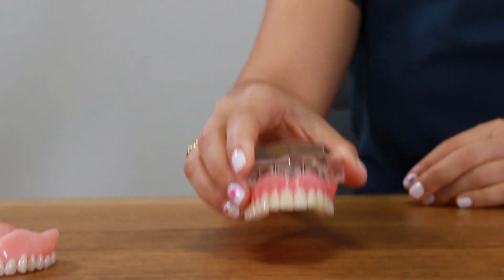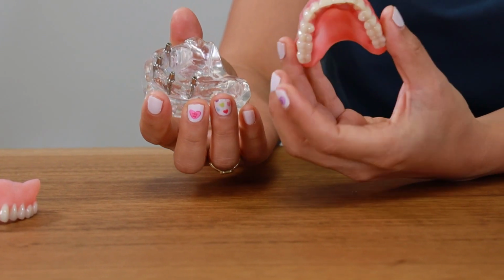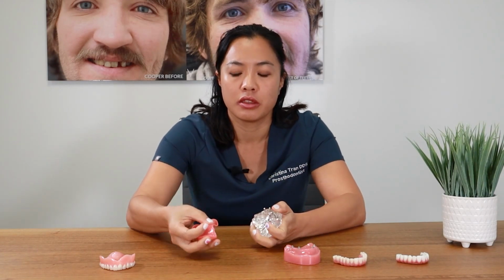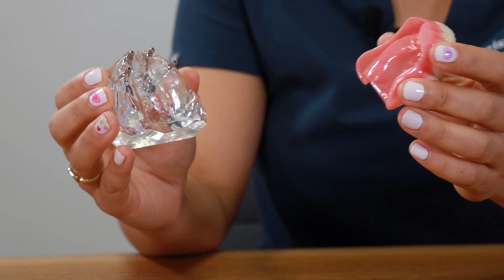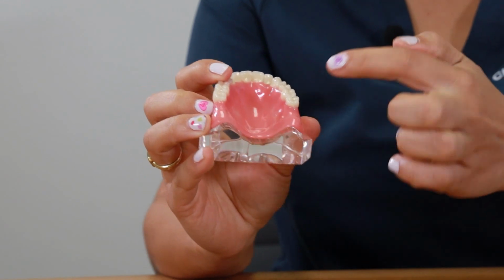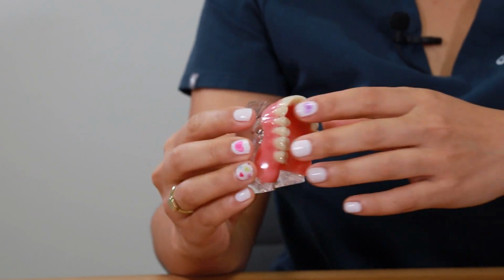Our next device is a snap-in denture. A snap-in denture is kind of middle of the road in terms of cost and function. You'll have implants. They're usually placed in the front, and there are reciprocal snaps, so it clicks in like buttons on your shirt. These are supported with a combination of the implants and the soft tissue, so you're still getting tissue contact in the back, and there's usually a little bit of rotation. You still have your palatal coverage in most instances, although it can be thinned out a little bit.